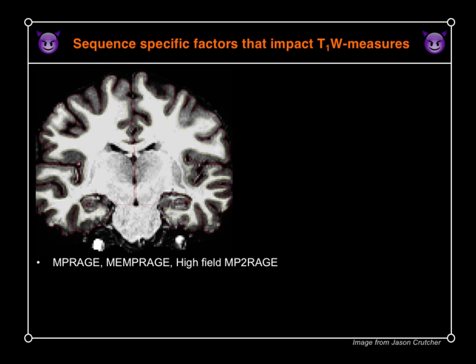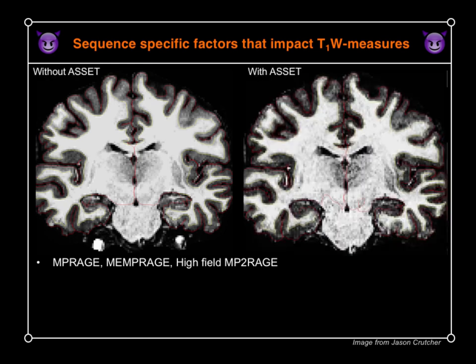What happens with this sequence is that you have the option of using acceleration or not using acceleration. Acceleration is something that you use when you have a very complex coil, like a 32-channel coil. So you have a multi-array coil, and in the interest of reducing the scan time, you can use different factors of acceleration, and you can get these images in half the time.